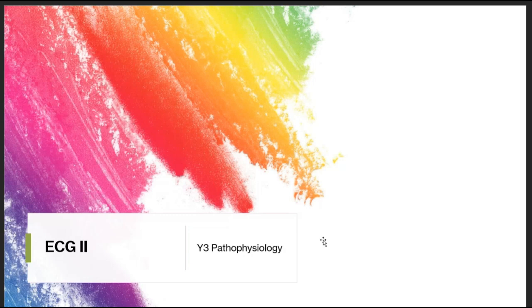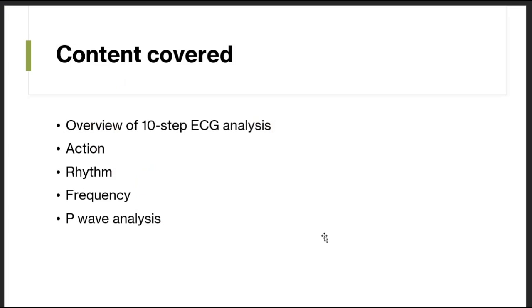What I'll be covering exactly is an overview of the 10-step ECG analysis, and then I'll go into depth on what is required, at least, for the action, rhythm, frequency, and P-wave analysis. For the other parts, my colleagues will record their respective parts and it will be shared with you.